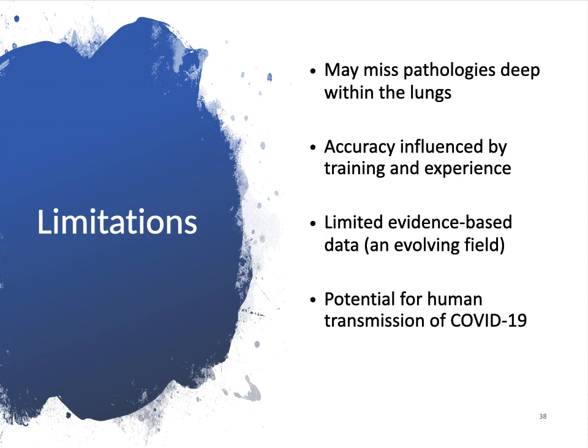The second limitation is that the accuracy of lung ultrasound is influenced by training and experience. So training is very important, and you get better the more experience you have, like any diagnostic modality. But the good news is you don't need longer time to get trained on lung ultrasound.